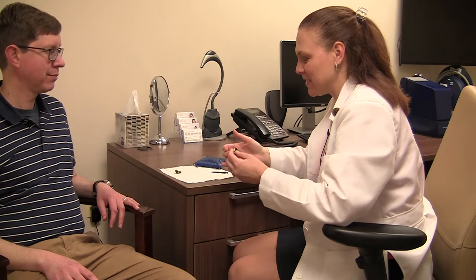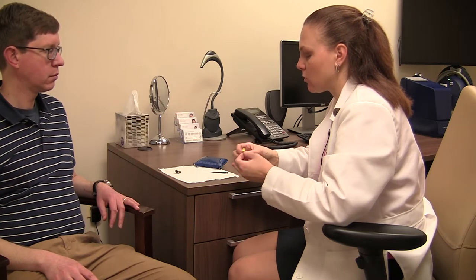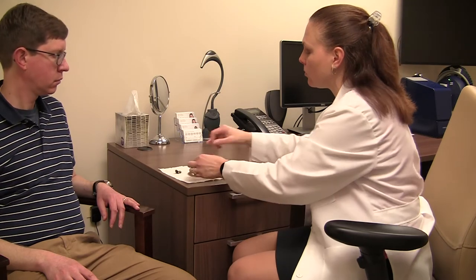The devices are set up so that you'll know very quickly which one goes in the right and the left ear. The left side has a little 'L' for left and it's color coded blue. You've got your 'R' for right and it's color coded red. So: red, right; blue, left. You're going to get really good at looking at them and knowing.